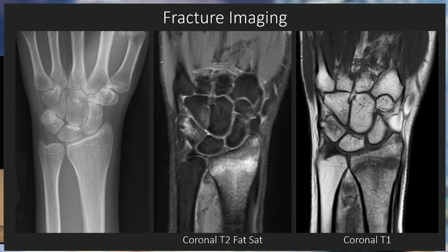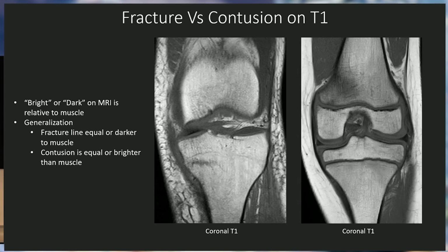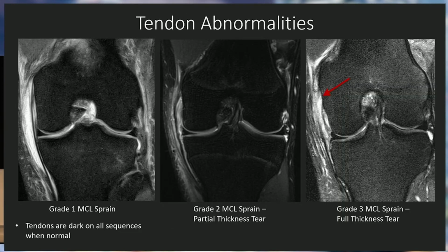I wanted to skip ahead a little bit and talk about rotator cuff, because I worked with a shoulder guy, so we did a lot of rotator cuffs. One of the things you had mentioned was the Moe, Larry, and Curly, and I'm old enough to remember the Three Stooges, watching them many times. I really like that analogy. Would you mind going through your thought processes on tendinosis versus partial tear versus full thickness tears, and how you kind of fish those things out?